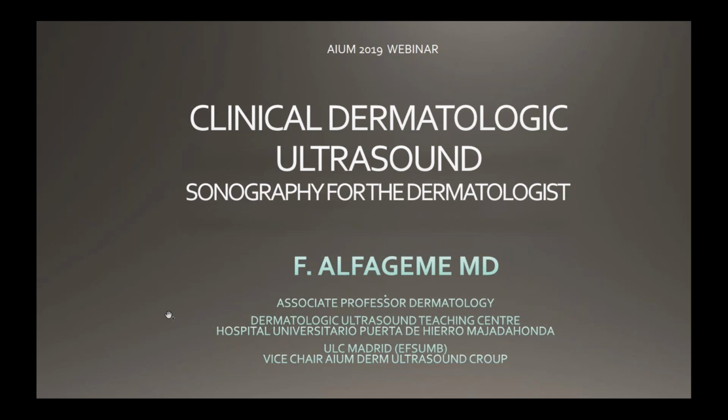That's sometimes much more a matter of communication between specialists, as you will see, than the applications themselves, which are numerous, and the possibilities are enormous. The only difficult thing after this webinar is how you convince your dermatologist that you can offer services and information that may be relevant for a better management of their dermatologic patients.